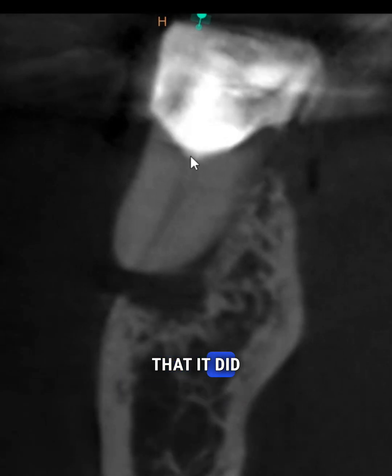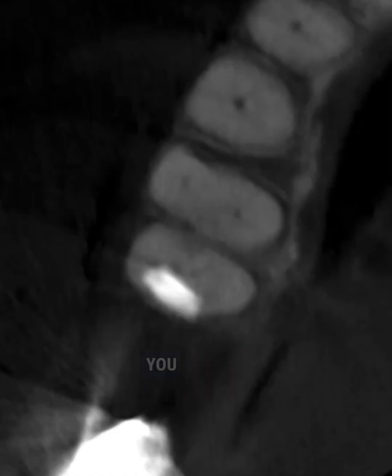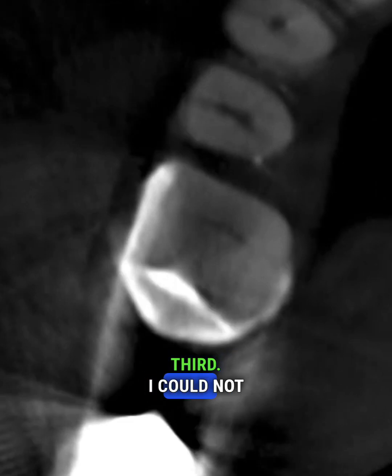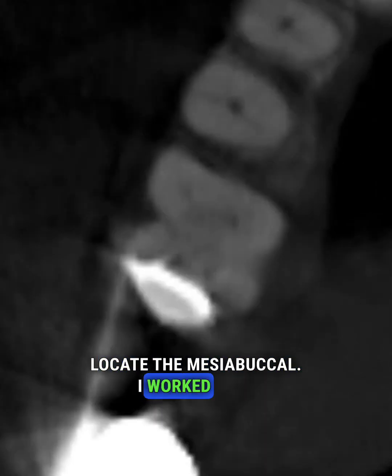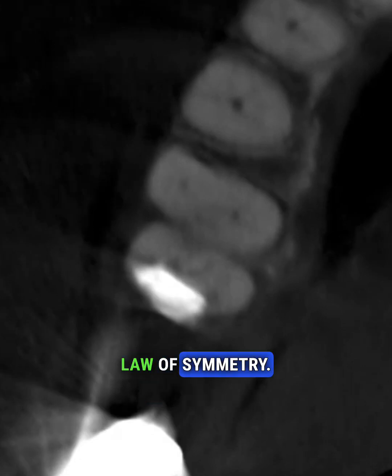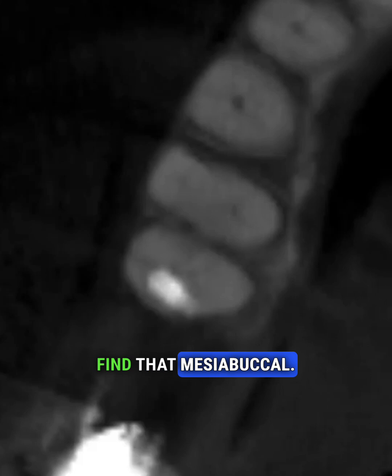Here's the distal. You can see that core is close to the distal filling, but when you look at different angles, you can see that it did not actually cover it, which was fortunate. Now, I worked very diligently. You can see there's a mesiobuccal and mesiolingual canal up in the coronal third. I could not locate the mesiobuccal. I worked very hard and diligently. I tried to use all my spatial orientation, law of symmetry. I could not find that mesiobuccal.